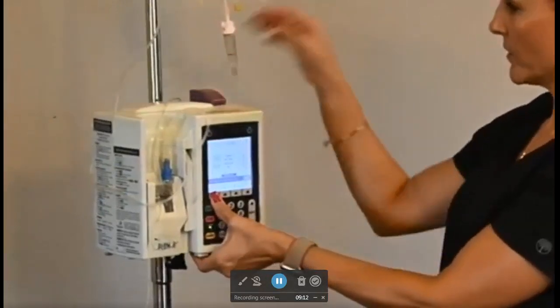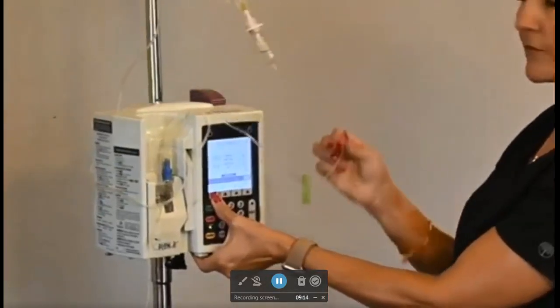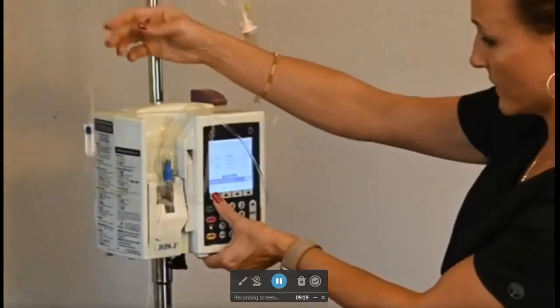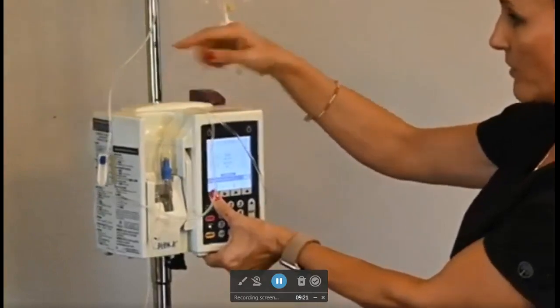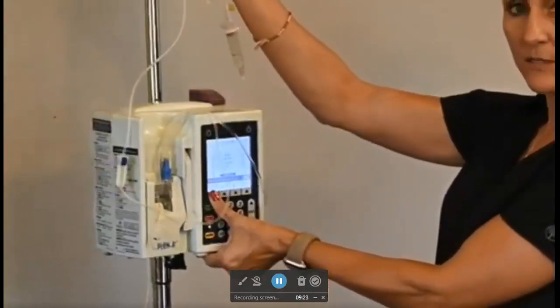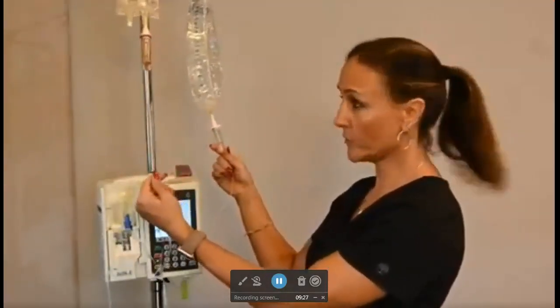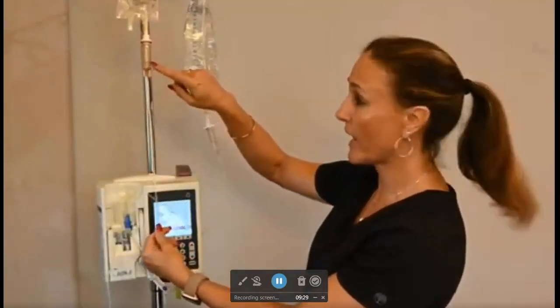You can see how it's taking from the primary bag and it's filling up all the way to the secondary bag. I would keep doing this all the way until I get fluid into this pump. Once I have back primed the secondary tubing all the way until I have the chamber about halfway full, I would go ahead and program my pump.